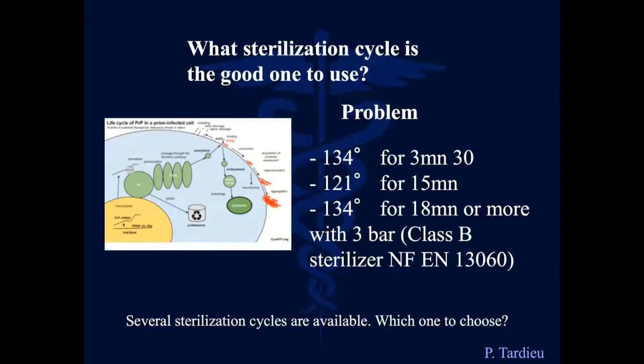What I would like to add is, if you are using the labels, don't put the labels on the pouches before sterilizing, because they are going to become all dark, all black, and you will see nothing. So the time to place the labels is at the end, after the sterilization is done, not before.